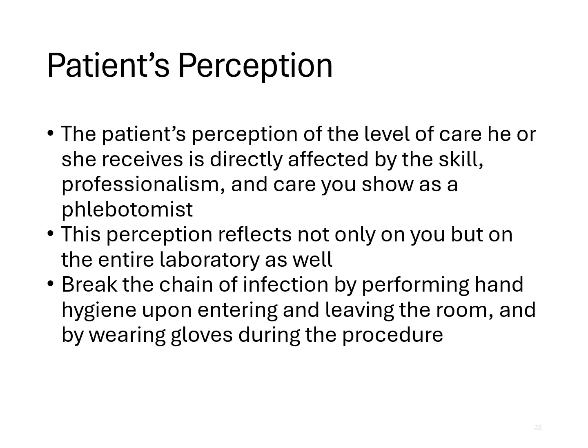Patient's perception. So always remember that the patient's perception of the level of care he or she receives is going to directly be affected by the skill, professionalism, and the care that you showed when you were with them. This perception reflects not only on you, but the entire laboratory and possibly the entire organization. So break the chain of infection by performing hand hygiene upon entering and leaving the room and by wearing gloves during the procedure.